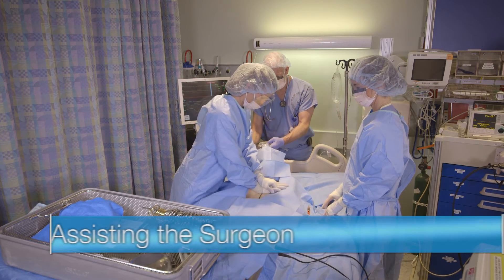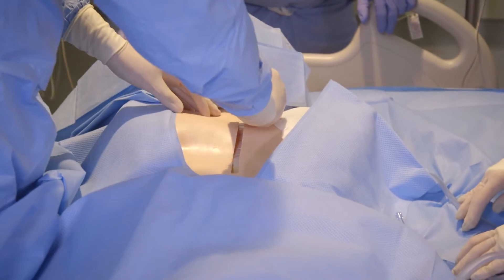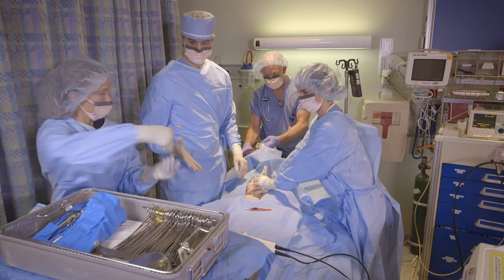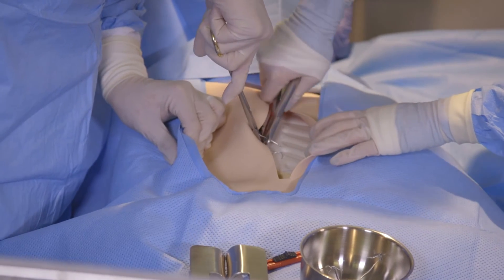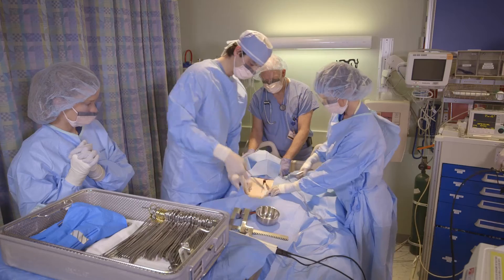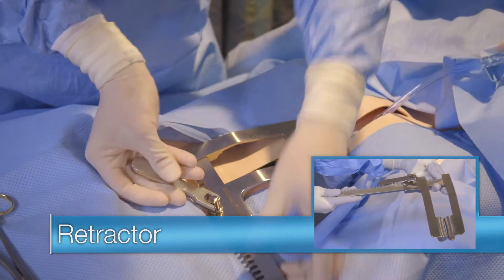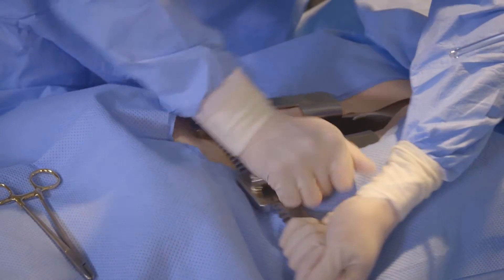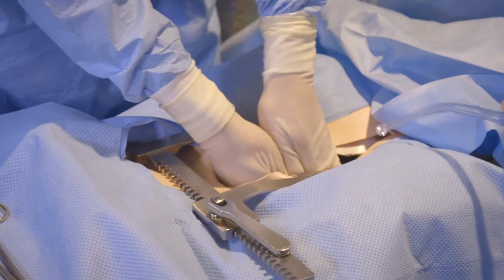Once the surgeon arrives, he or she will gown and enter the room. The mid-level will hand him the scalpel and then assist in cutting the sternal wires. A retractor will be used to visualize the heart. The sterile suction that the tamponade nurse has set up will be used to assess graft sites.